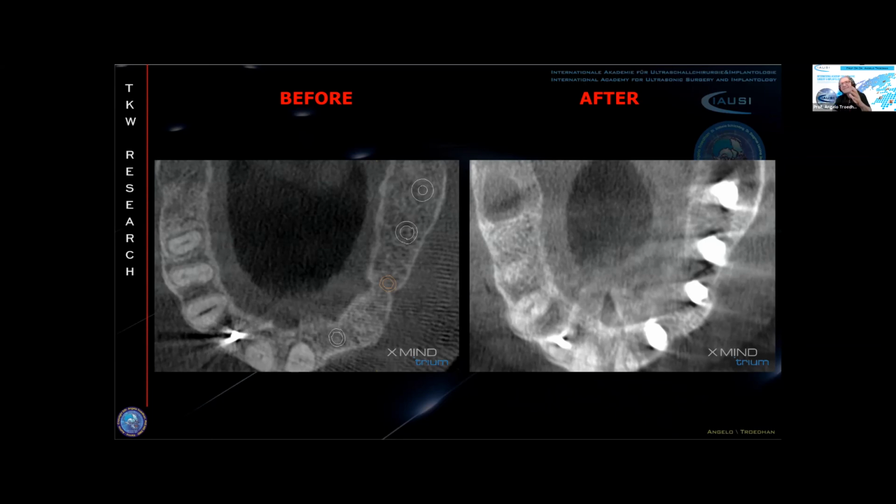What in case something happens during the surgery, especially during the crest split? You don't follow the protocol, you have some accidental fractures. Then if you are not trained to insert implants without surgical guides, what are you going to do? Because the normal human reaction is you get into panic, and then of course panic is the best reason to make another failure, and then the whole surgery will be a disaster.